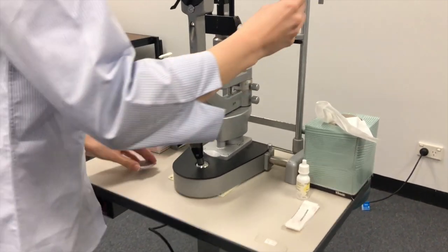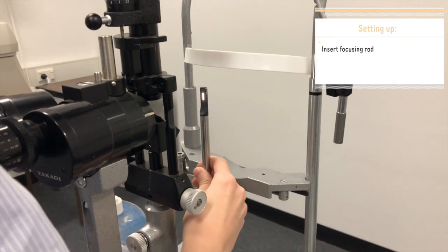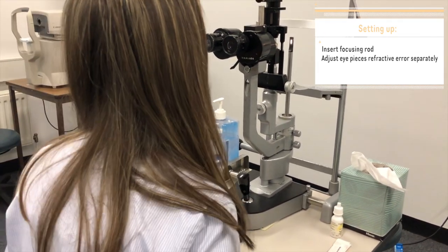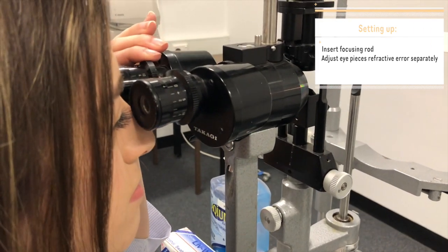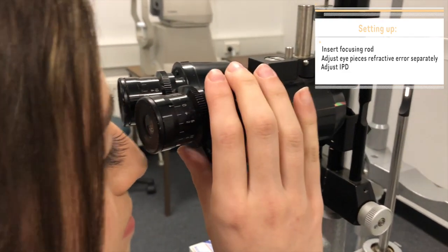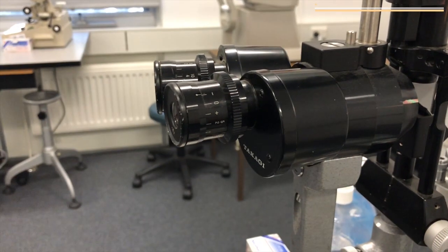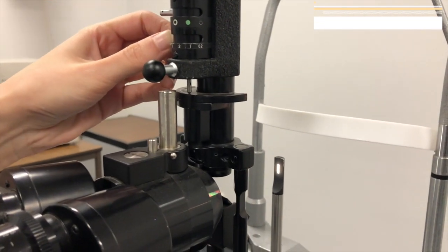The examiner then removes the guiding plate and inserts the focusing rod with the flat side facing the microscope. Each eyepiece will be adjusted separately to suit the examiner's refractive error. This will be apparent when the slit of light is in sharp focus. The IPD should also be adjusted to suit the examiner. Now the examiner adjusts the light to its fullest height and widest beam.